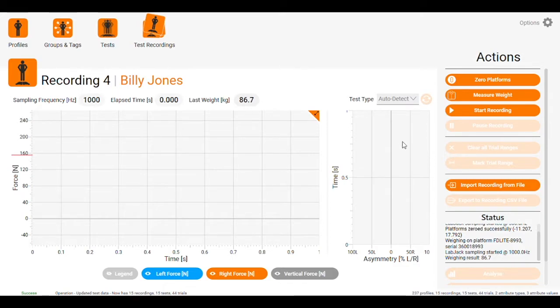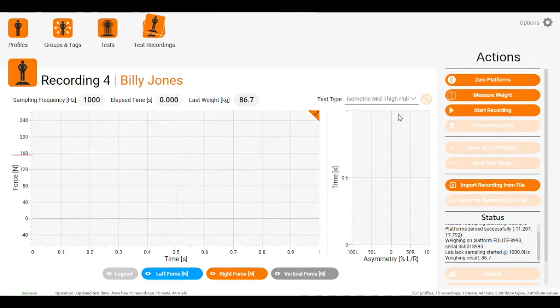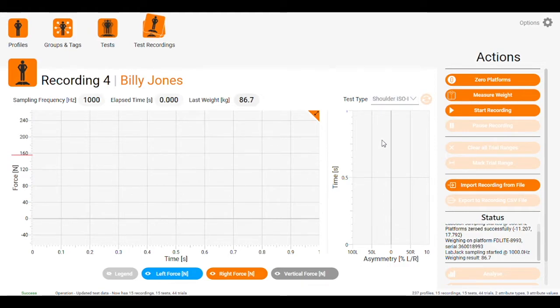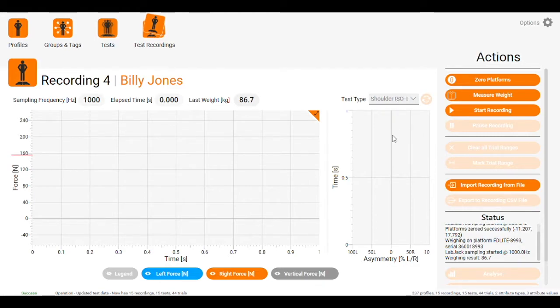There's a dropdown here that you can't see on your screen. For an isometric mid-thigh pull, we would scroll down and select isometric mid-thigh pull. The same for the athletic shoulder test: shoulder ISO-I, shoulder ISO-T, and shoulder ISO-Y.